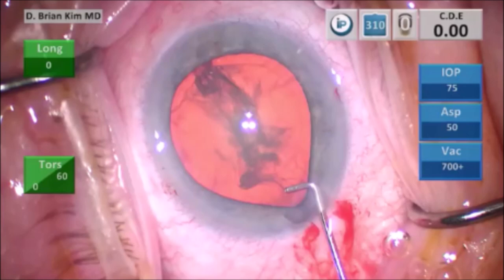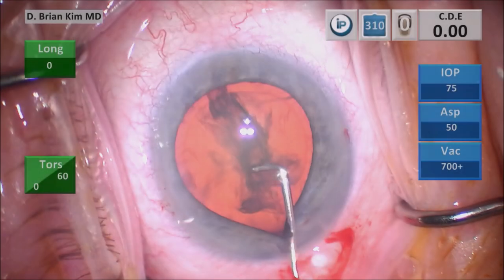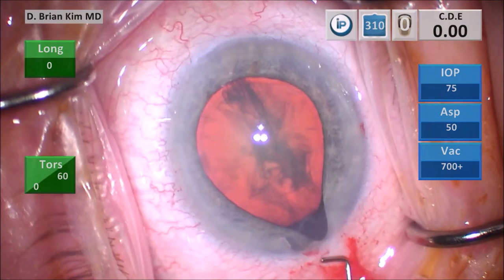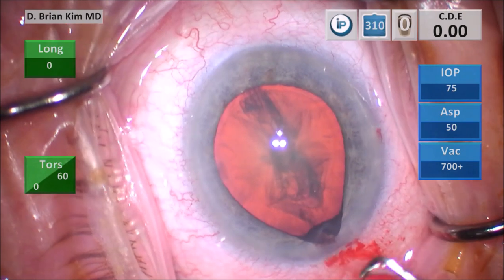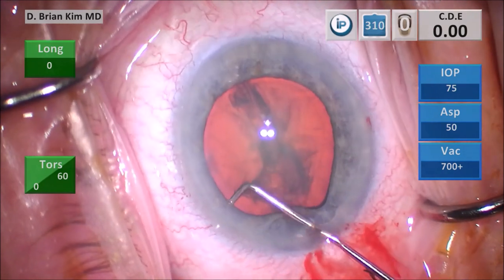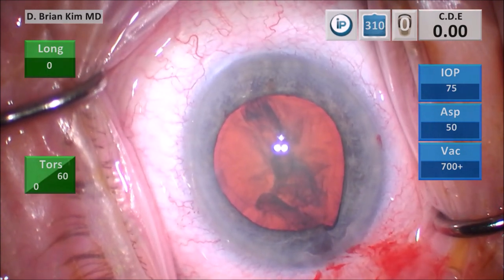So, what am I supposed to do? The first thing you don't want to do is push more OVD into the eye. The reason iris comes to the wound is because the intracameral pressure is far higher than the external pressure. When you burp the wound, the iris just follows the path of least resistance and herniates out of the wound. You have to reduce the intracameral pressure. You can see I'm using the cannula to burp as much viscoelastic out of the eye as I can. As I'm pushing, I'm encountering iris because it continues to want to come forward. But that is the goal — burping the wound as much as possible to allow as much OVD out of the eye as possible. You don't give up; you just keep pushing. Finally, the iris will not come to the wound anymore.